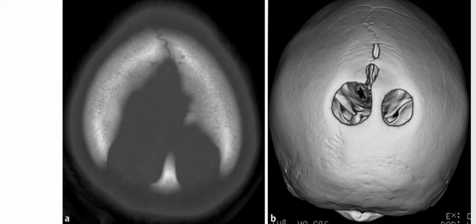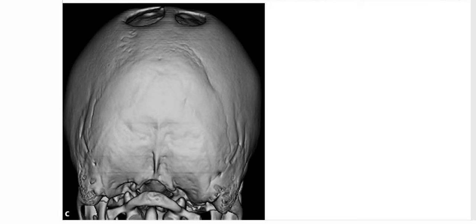These are images of a 10-year-old girl who presented with soft spots. The axial CT scan and 3D reformatted image with posterior view show paired circumscribed ossification defects of the parietal bones separated by a midline region of ossification.